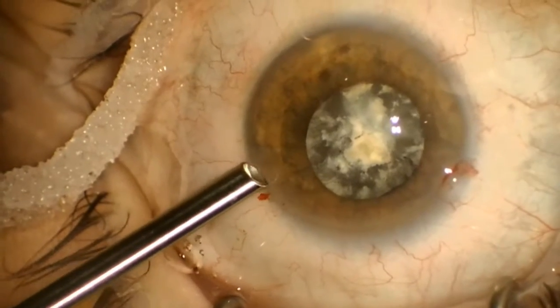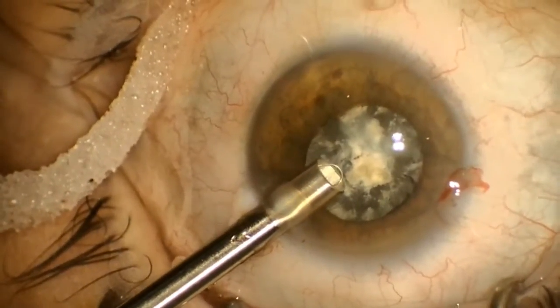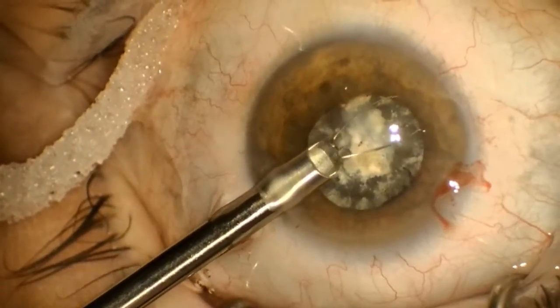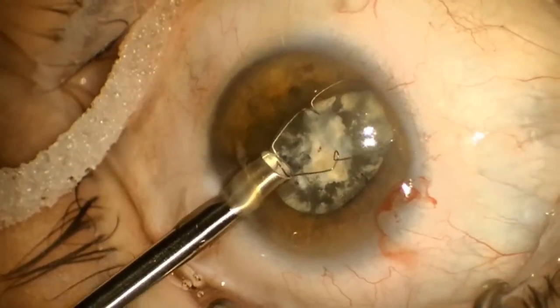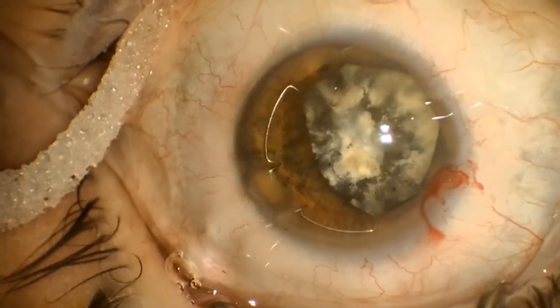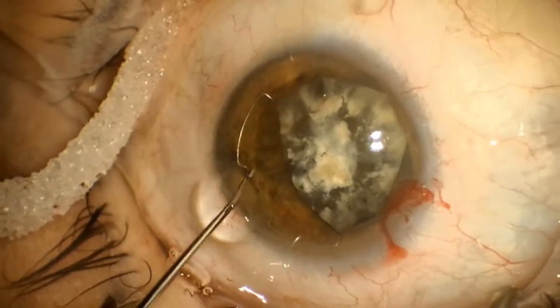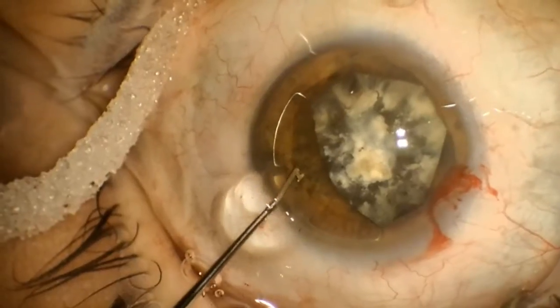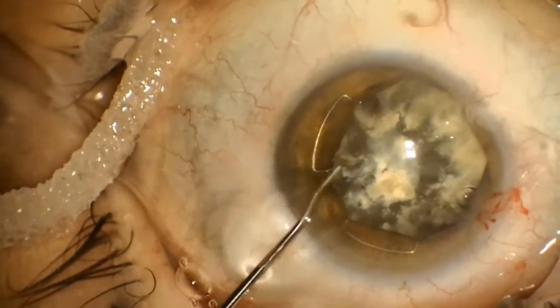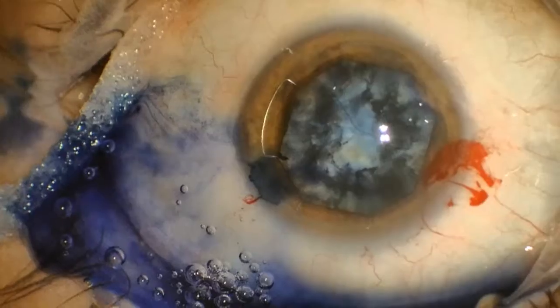Here you can see the injector going through the 2.4 millimeter corneal incision. The plunger is advanced and the ring is engaged first at the opposite side of the iris. As the ring deploys, one lateral foot followed by the other are engaged. I found it very easy to get all three of these feet placed at the initial deployment. The last foot has to be engaged with the second instrument — most common hook instruments will suffice. And you can see that there's minimal iris stretching when that fourth foot is placed.